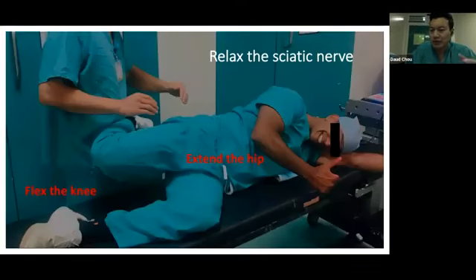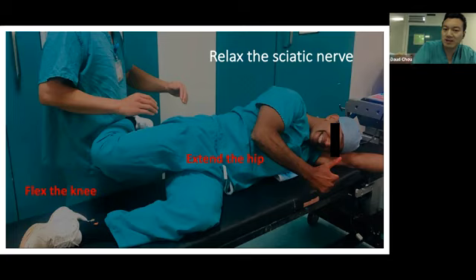And at this point, we're hoping to protect the sciatic nerve, and so we need to relax the sciatic nerve, take the stretch off the sciatic nerve, and in order to do that, you need to extend the hip and flex the knee. And the way I do this, and the way I try not to forget to do this, is I have the patient's shin resting on my abdomen, and in that way I can flex the knee and extend the hip whilst having my hands free still to operate on the acetabulum. And so this is the kind of position that I'm in when I'm operating at the back of the posterior column, trying to avoid stretching the sciatic nerve.